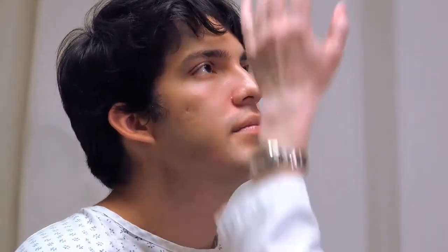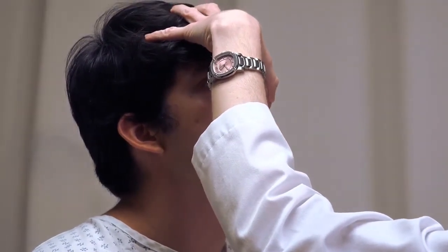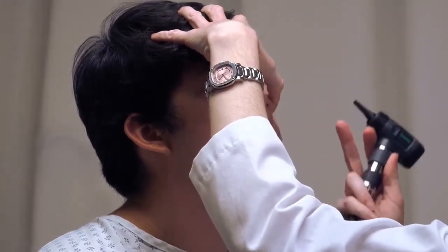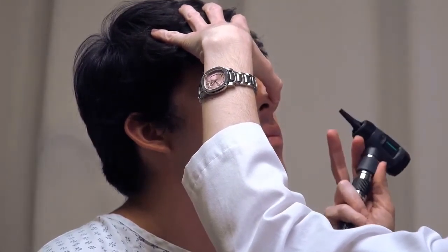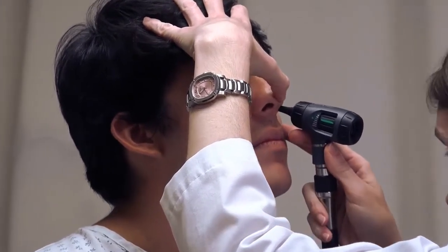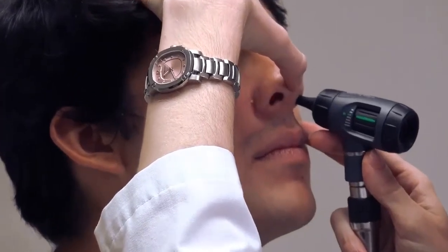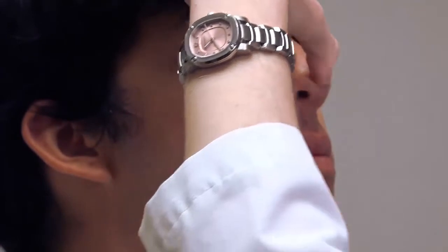Ask the patient to tilt their head back slightly and put a little traction on the tip of the nose to open up each nare. Anchor your finger on the patient's face to avoid excessive pressure from the otoscope. Gently insert the otoscope just past the nasal hairs and examine the septum and turbinates. Since the patient is breathing, either ask them to hold their breath or work quickly so you don't fog the lens.